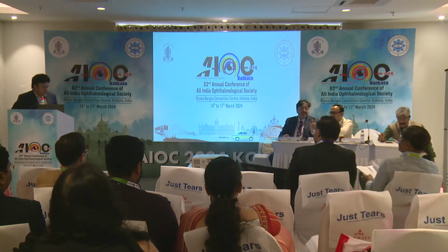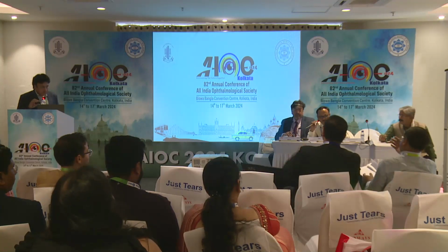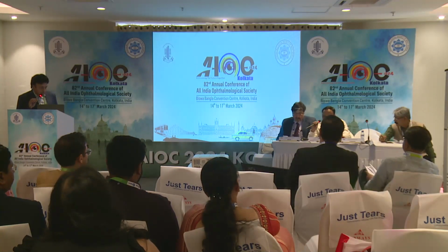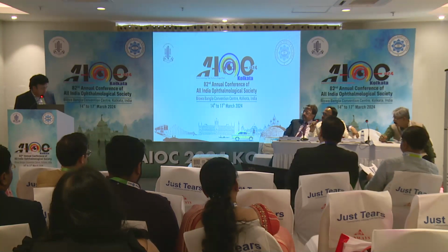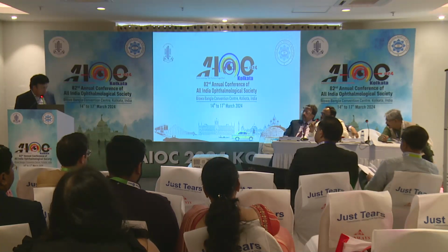Questions. So, Dr. Ajay, very nice videos. I just wanted to check because you did a 2-point fixation of this foldable IOL, that too in the sulcus, right? So, how did it go? Did you feel any problem? Because most of the time we avoid putting this foldable IOL in the sulcus, and you have a 2-point fixation also with suture.